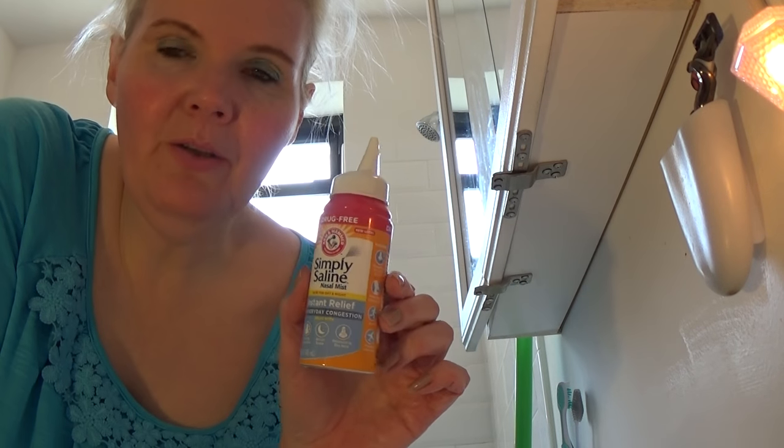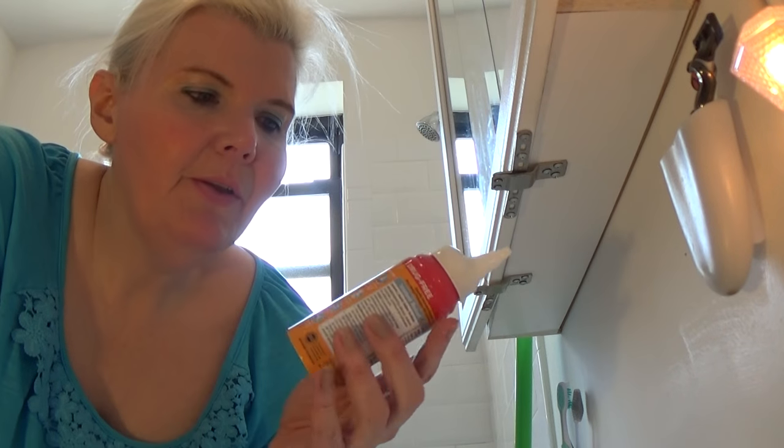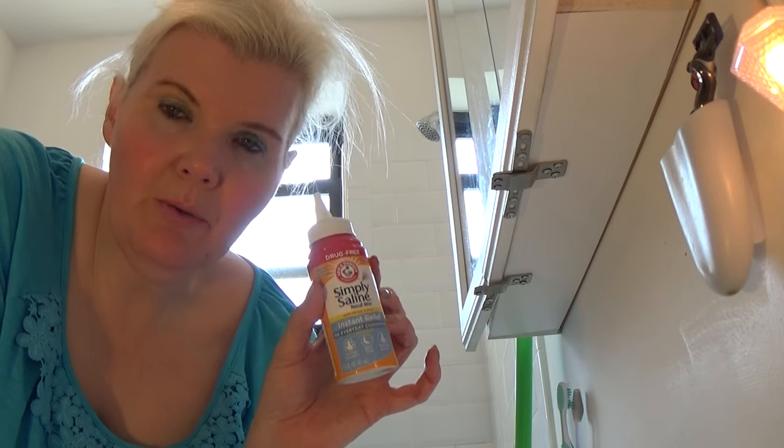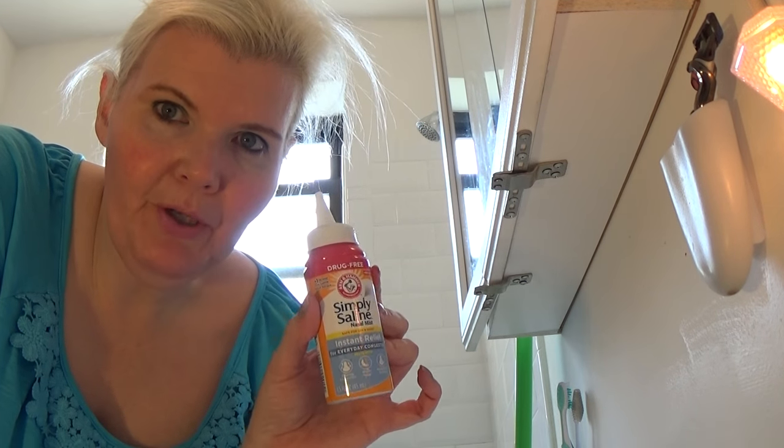If you've ever used a neti pot, you know how annoying it is because you have to keep the water very clean. This is much easier. If you have allergies or a sinus infection, you see a doctor — most likely they're going to tell you to use a neti pot. This is a much better alternative; it's safer and it's cleaner.